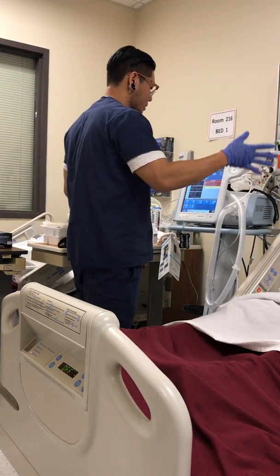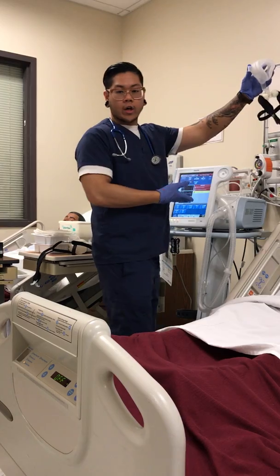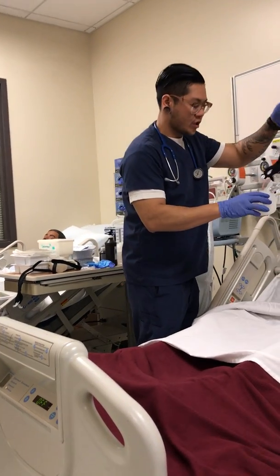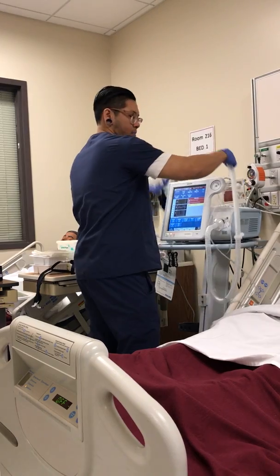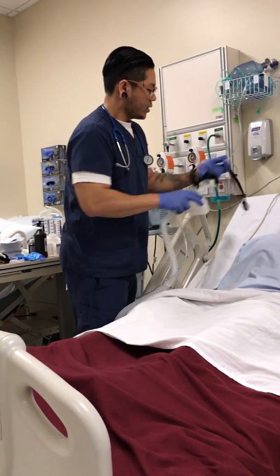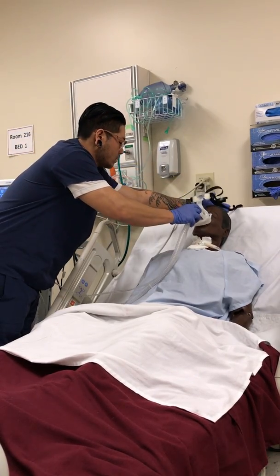Okay, so now that he's sized, I'm going to work on the alarms after I fix the mask on for him. For patient comfort, you want to take the mask and connect it first. There we go. I'm going to talk to the patient and say, I'm going to put this over you, and we're just going to try to get you comfortable with it, okay? See how it feels. Okay?